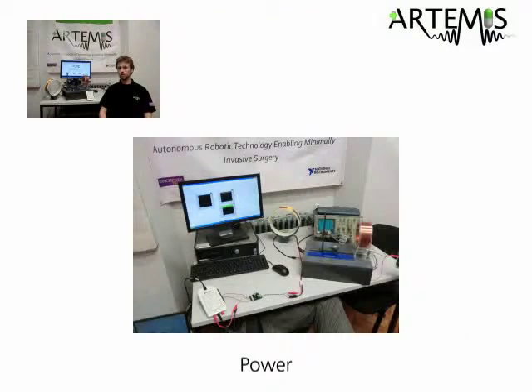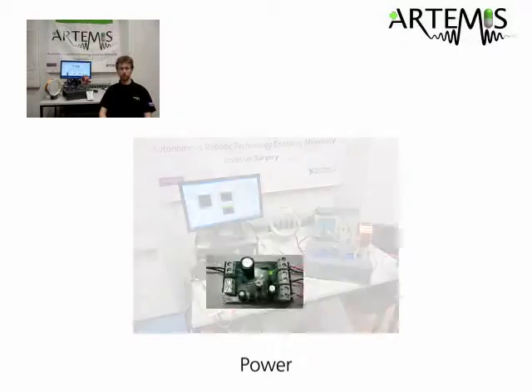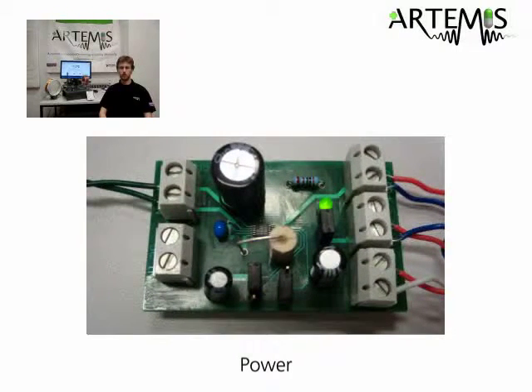On the other side of the system, i.e. the power that goes inside the body, we needed a circuit that would convert the induced voltage on the secondary coil to a stable DC voltage that would power all the devices in the capsule. The circuit also had to be able to store the unused energy. To do this, we designed an energy harvesting circuit based around the LTC3588-1 from Linear Technology.